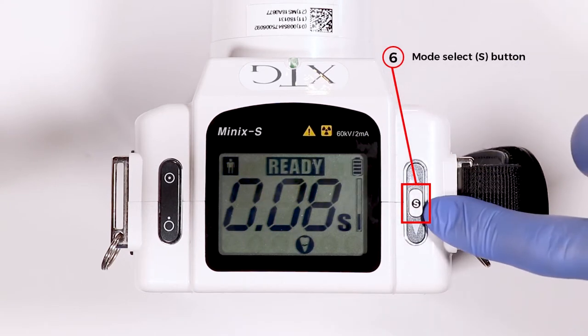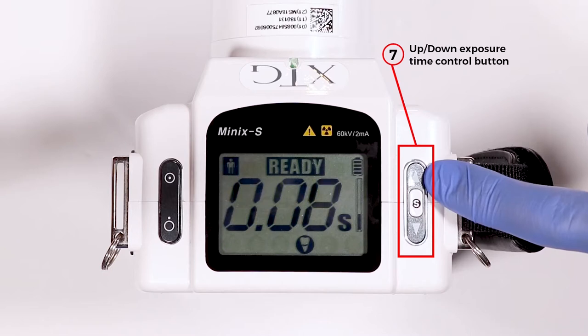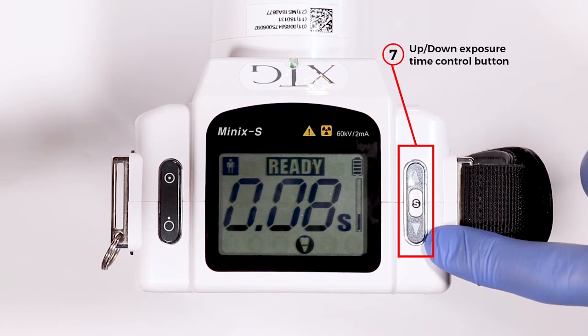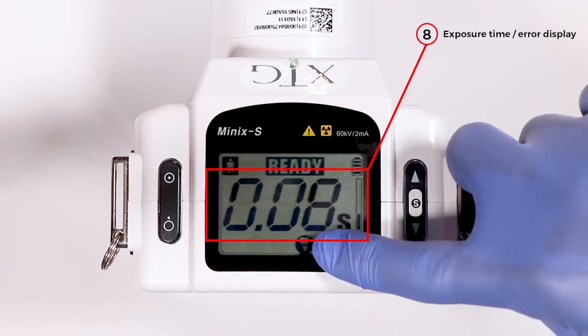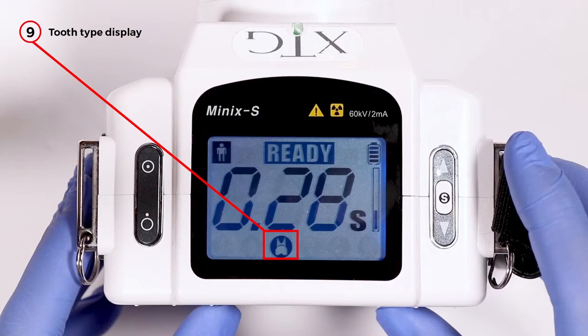Six is the mode select, the S button. Seven is the up down exposure time control button. Eight is exposure time / error display. Number nine is the tooth type display.